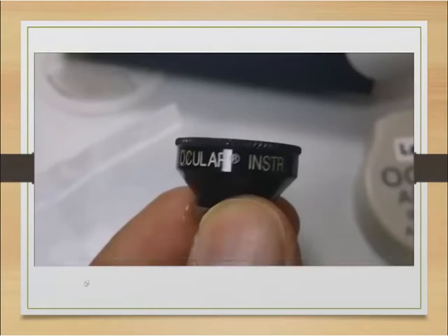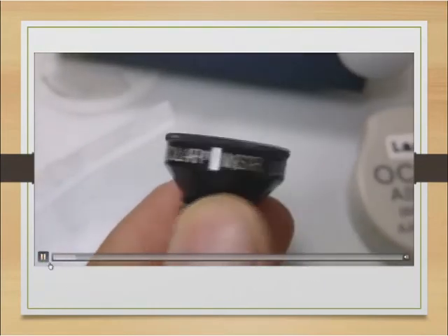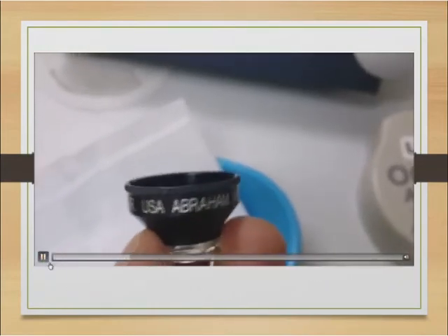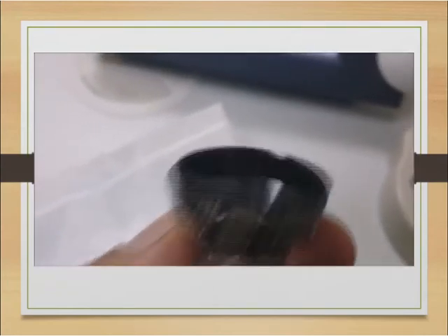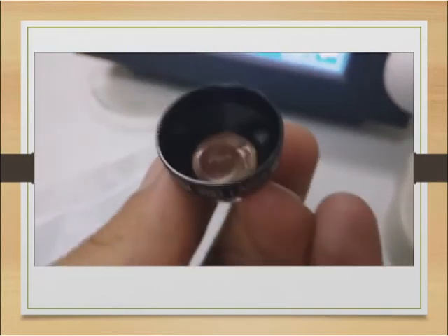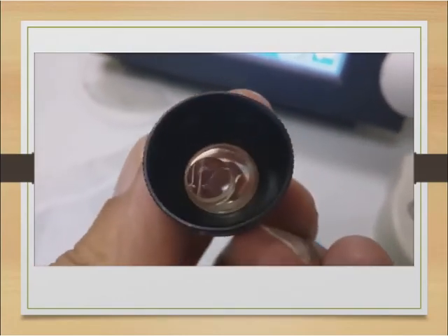Here's a video of what the lens looks like. You can see it says 'Ocular Instruments, Abraham' and 'irid laser' on it. If you tilt it forward, you'll see there's a little magnified section — that's the section you look through when you put it on the eye. Have a look at that lens — that's the one you use.